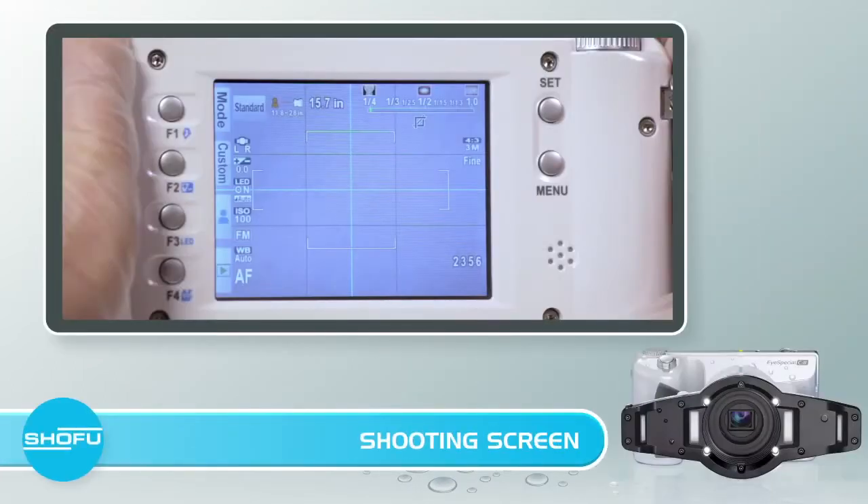Now that you have selected your mode, you will come to the shooting screen. You will see four options running down the left side of the screen: Mode, Custom, Patient ID, and Play. Next to each of these options, you will also see four buttons running alongside the screen — F1, F2, F3, and F4. These buttons correspond with the options on the left side of the screen, giving you the choice to either press the button on the screen or press one of the F keys. Both options are easy to do with a gloved hand.